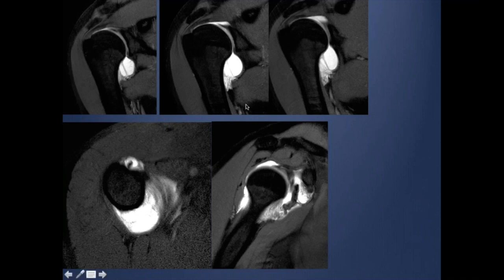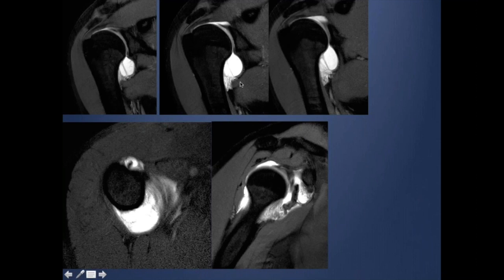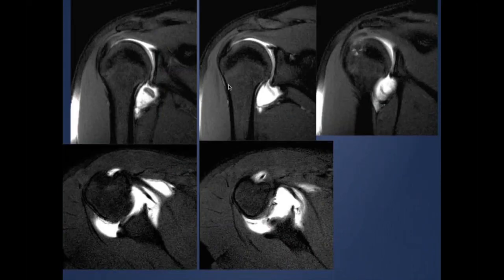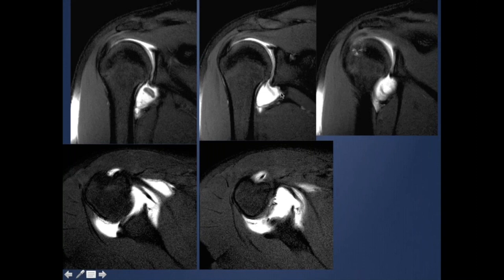On arthrogram, you can see the inferior axillary recess of the joint is very spacious, and there is extravasation of contrast between the humeral head and the glenohumeral ligament — appearing fuzzy and irregular. This represents a HAGL lesion: humeral avulsion of the anterior inferior glenohumeral ligament, allowing contrast to extravasate laterally. In another example, the axial images show the ligament avulsed from the glenoid side rather than the humeral side — this is the GAGL lesion. The key finding is disruption of the inferior glenohumeral ligament.